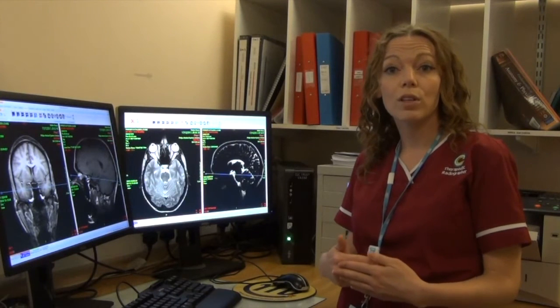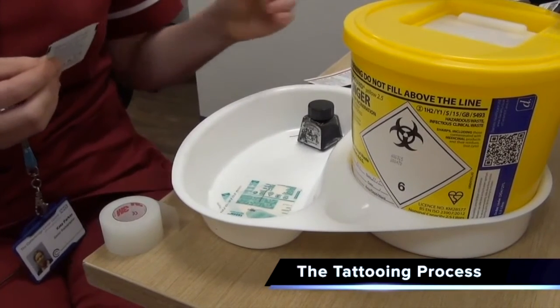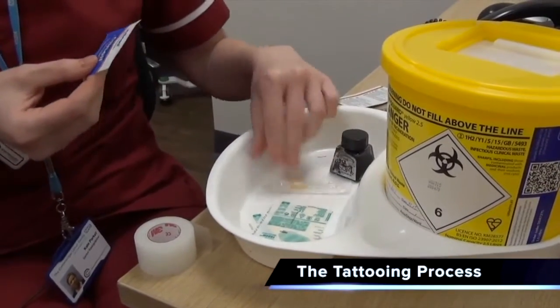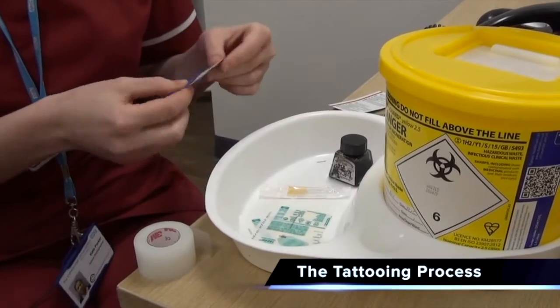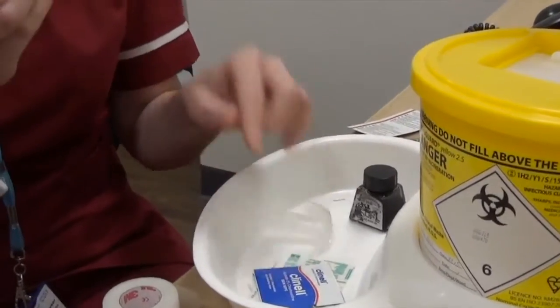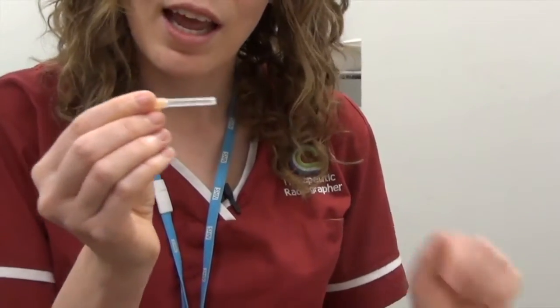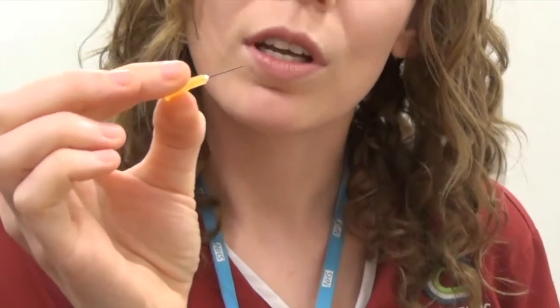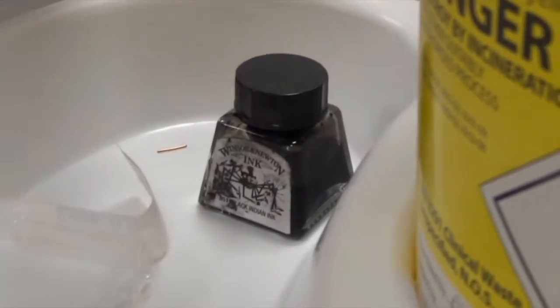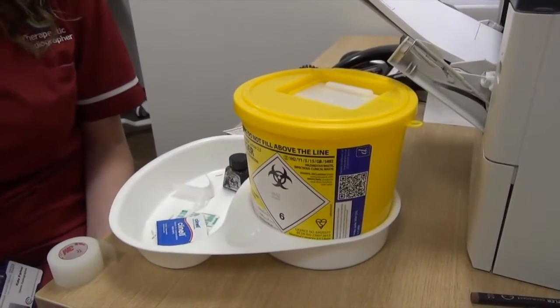The tattoo marks are reference marks — everything is given in relation to them. Once the area has been marked with a skin pen, a tattooing kit is used containing a wipe, tattooing ink and a small needle. The area is wiped clean, the needle is opened, dipped into the ink pot, and the ink is placed on the patient's skin. Using a very fine needle, the tip is placed into the centre of the inked area. A small needle is used so the mark is big enough for radiographers to see but not a permanent reminder for the patient.